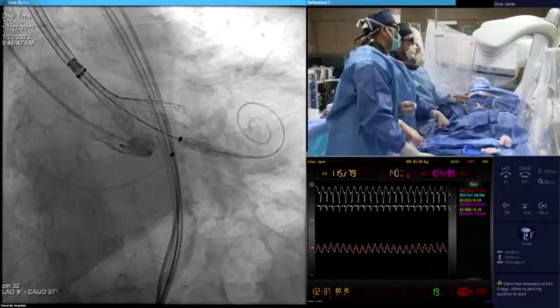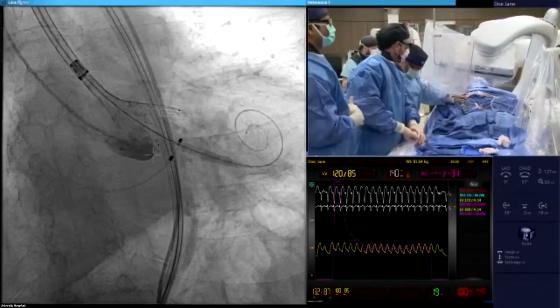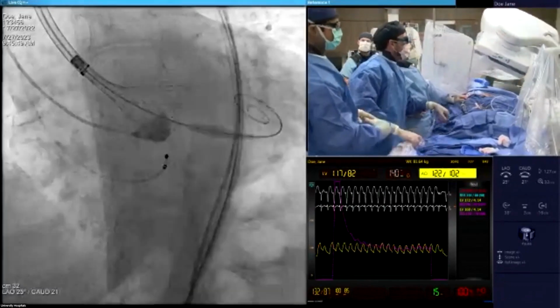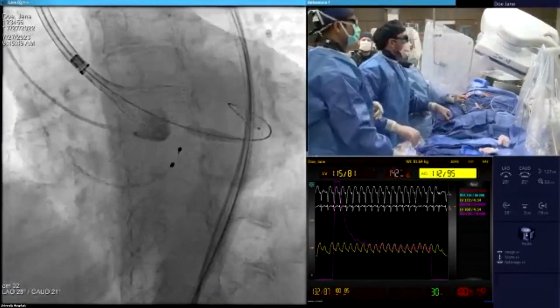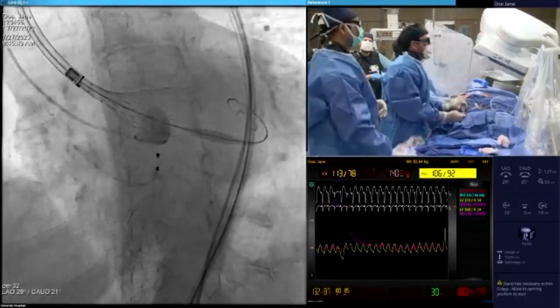Inject. That's our cusp overlap. Happy? Yeah, we like it. Hang on, can you... we lost all the video for a second. You look like you're about 2 or 3 millimeters deep, right? Yeah, I think we're good here.